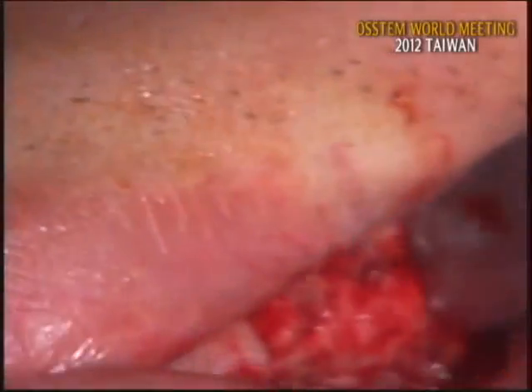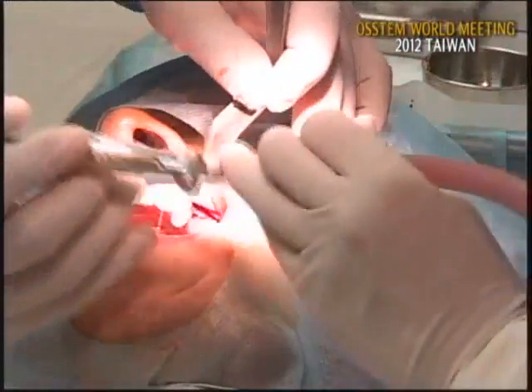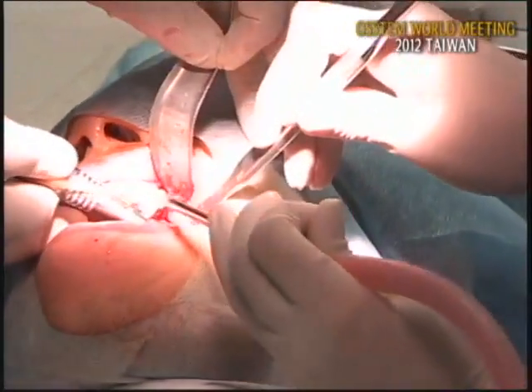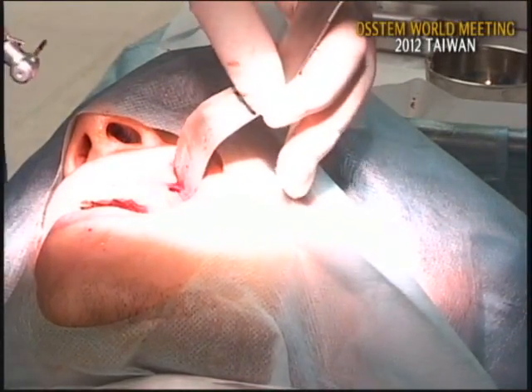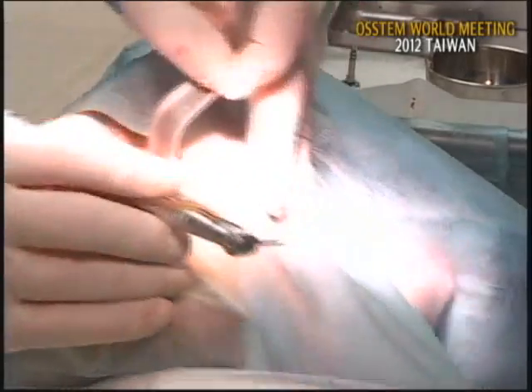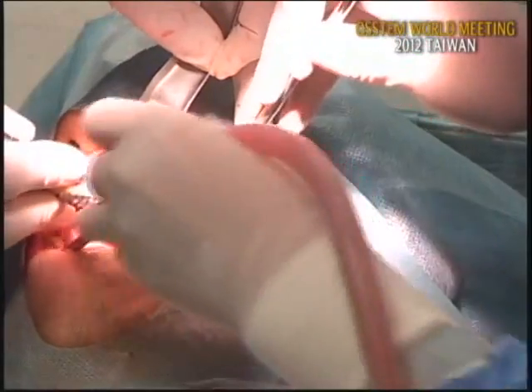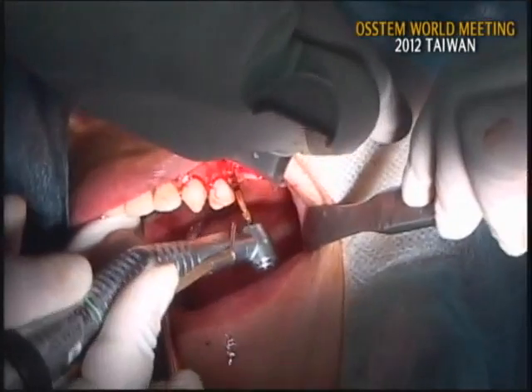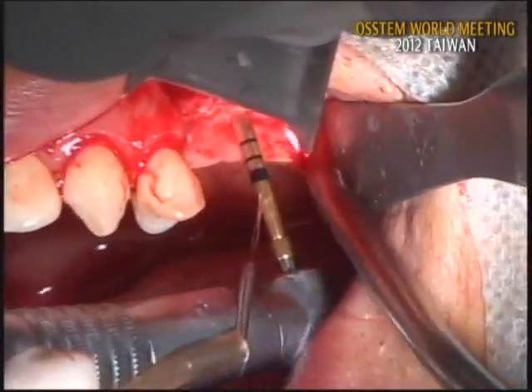So I'll prepare the drilling of the implant site. Open, please. I'll place 2 implants, 5 and 6. So let's check the width of the bone. Okay, I'll make the implant position. Okay, this guide drill. This is about 4 to 5 millimeters away from number 4. This is the number 5 premolar, second premolar site, and the molar site is here, around here.